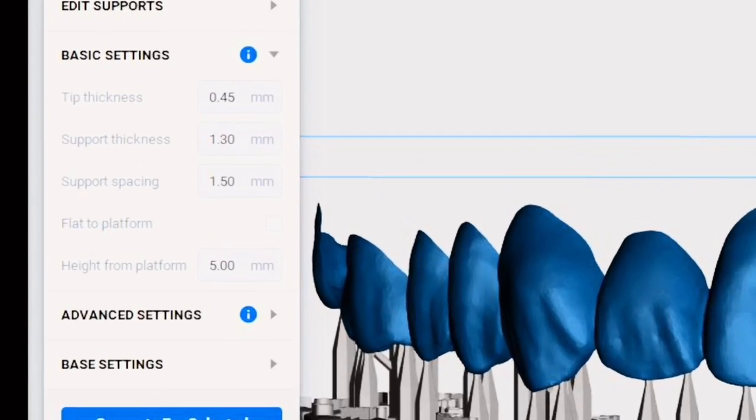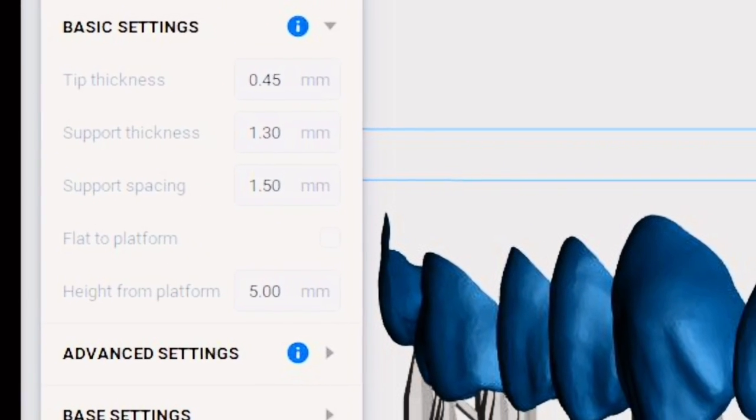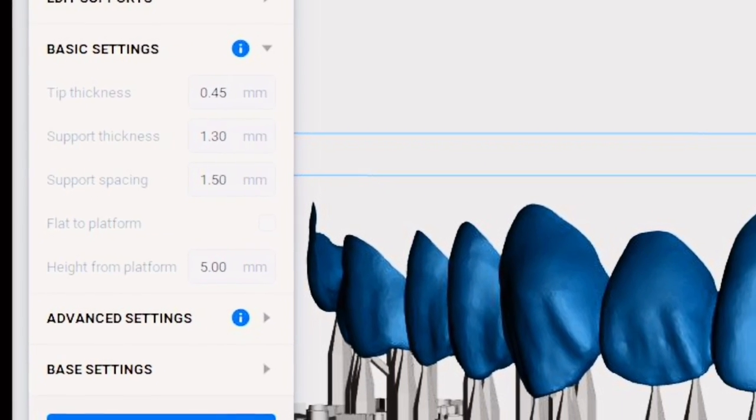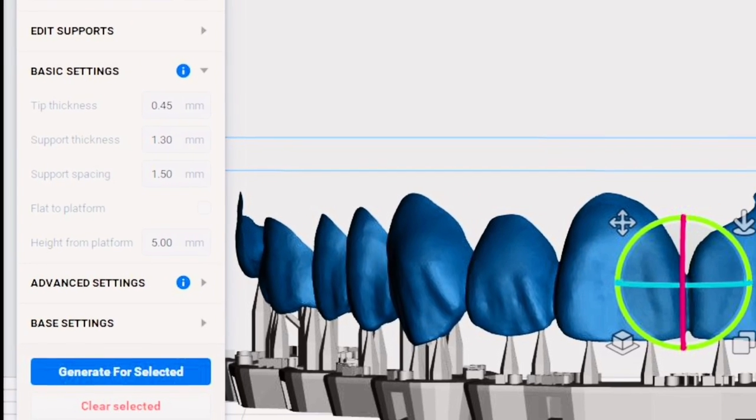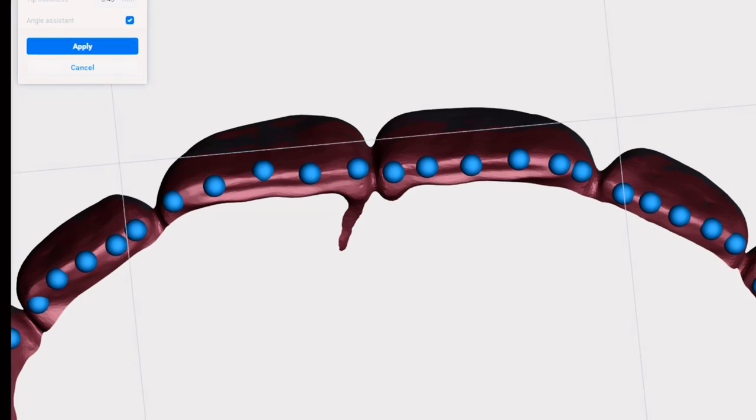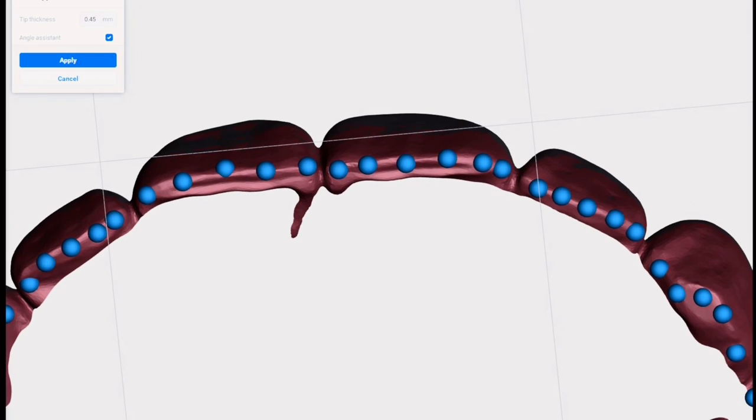For Flexera Smile we kind of cheat a little bit and we cut the support tip diameter down to 450 microns. These are basically needle-like tips and if you do this you have to remember to increase your support density. This is the spacing that I recommend for Flexera Smile Ultra Plus, whether you're printing teeth or dentures or veneers.